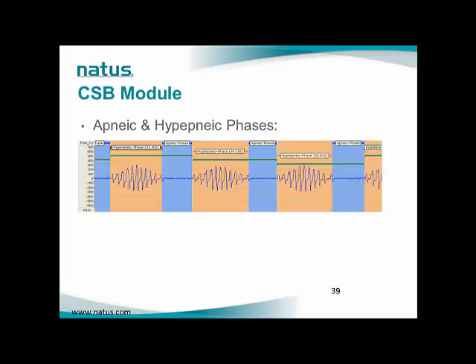The apneic phase represents the pause or the reduced ventilatory effort period on the flow channel, while the hyperpneic phase reflects the resumption of normal breathing.